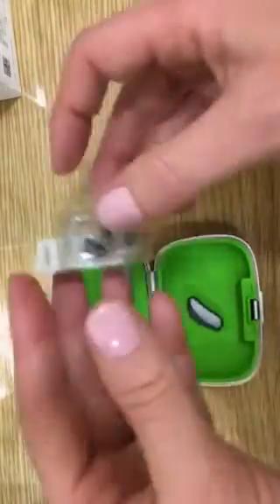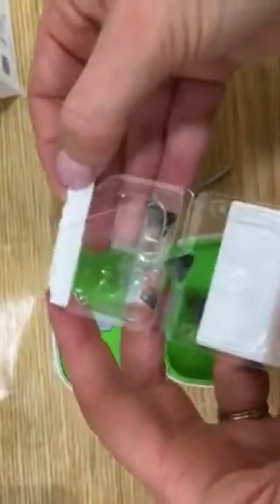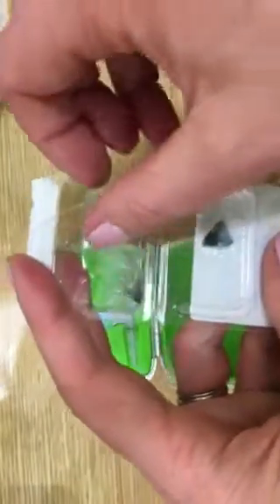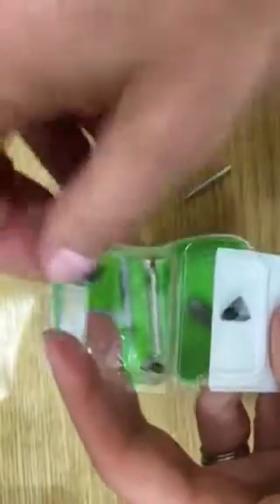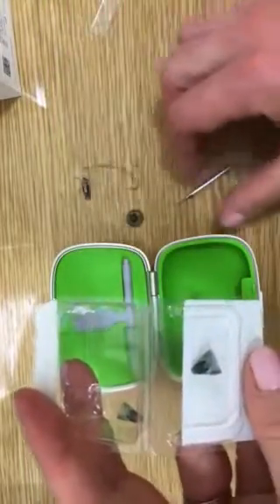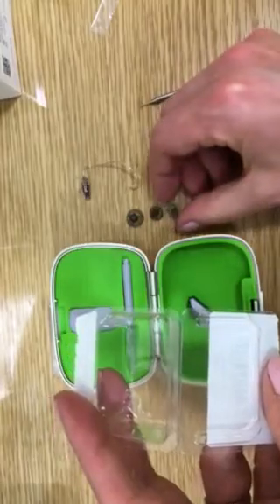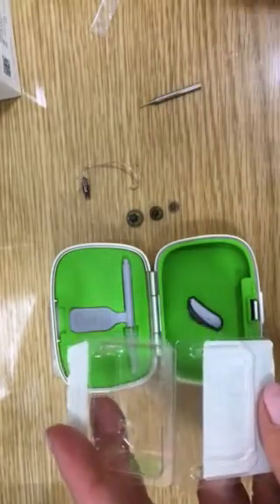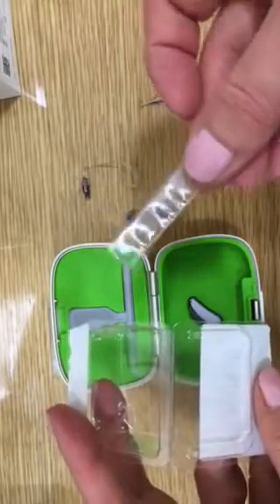Now open our new receiver. Each new receiver will come with three domes: the large dome, the medium dome, and the small dome. You'll also get a spare pin should you lose yours during the process.